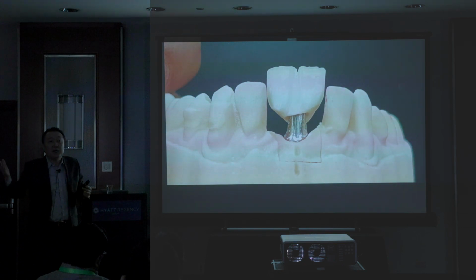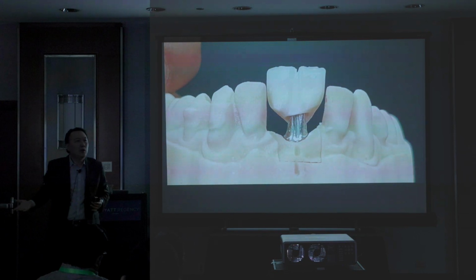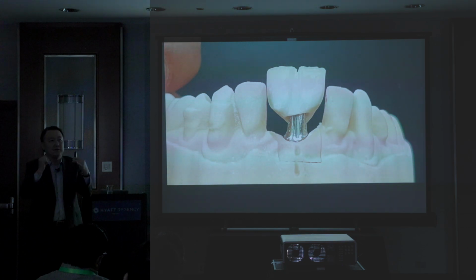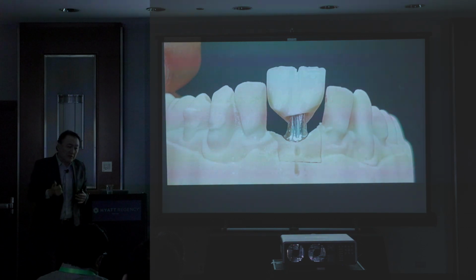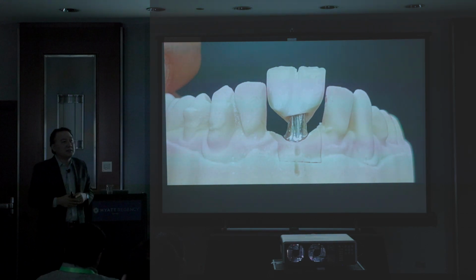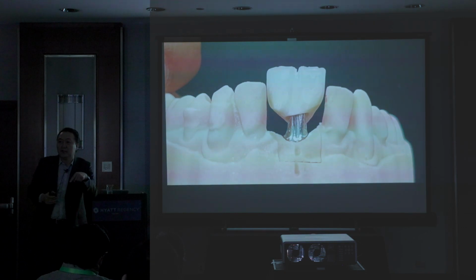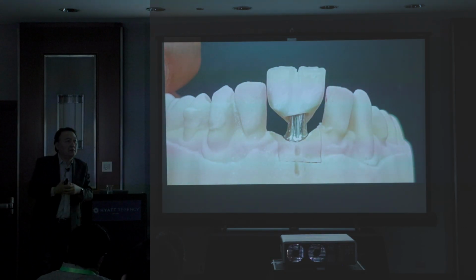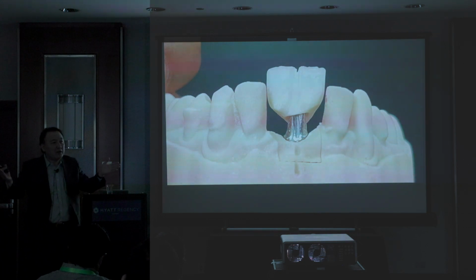And then what about the zirconia? Copy mill. What are they talking about, copy mill? Someone sets up the wax-up, right? Or PMMA, they like it. All right, copy. That's what they're talking about. So nowadays, I would say 70% of dentists hire a lab tech. $25, $27. If they're lucky, $30. Maybe $35 per hour. Doesn't matter to me.